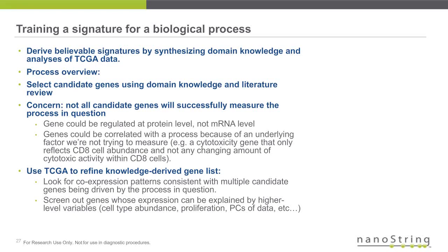So the first thing to begin with, Sarah mentioned all these signatures we've generated. And I think it's worth describing a little bit how we actually derive these signatures. There are probably more gene signatures that have been published than actual genes in the genome, so it deserves a bit of explanation why these signatures are actually useful and deserve attention. Let's see, so we've got a pretty rigorous process and a pretty selective process. We attempt signatures for a great many biological variables, and we actually fail our signatures in a good percentage of the time just for not having strong enough evidence.